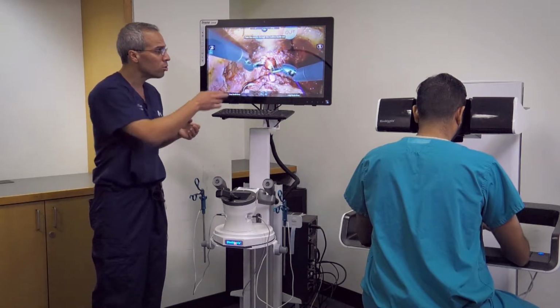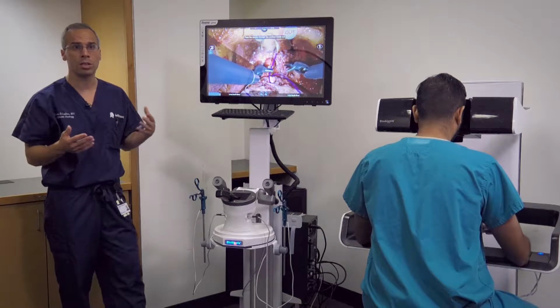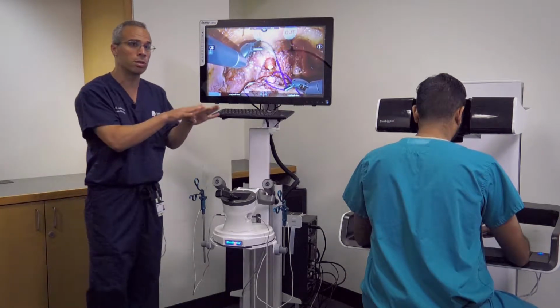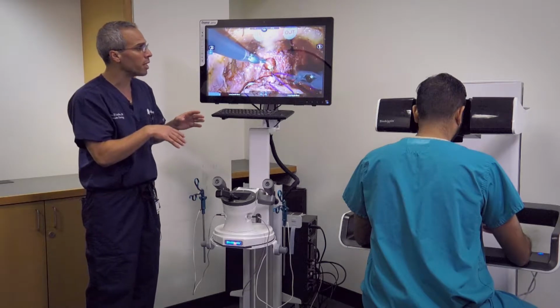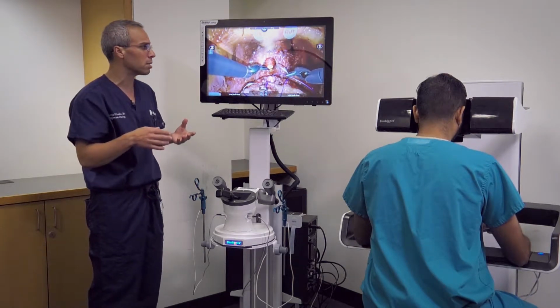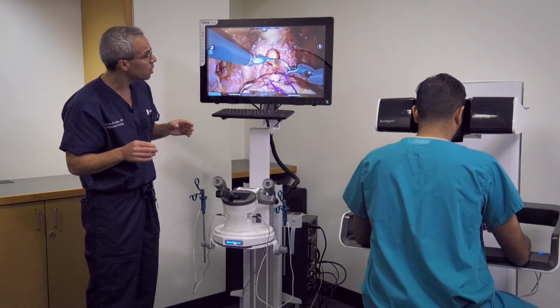So this suture that they're showing you is a barbed suture. This is what we use in the operating room. And it's a suture that has small barbs on it. All the barbs go in the same direction. And what that does is it gives you constant back tension. And I think it makes the anastomosis a little bit more tight.